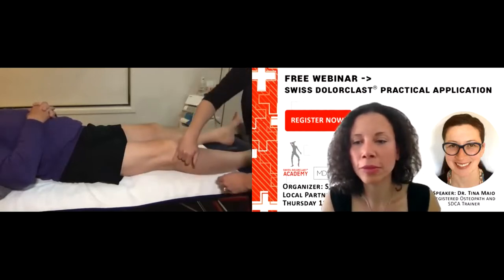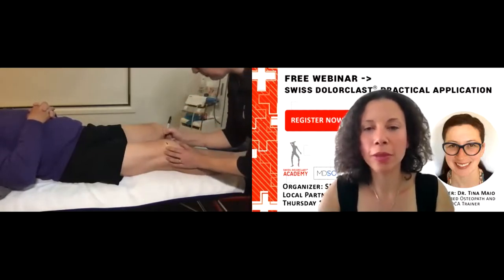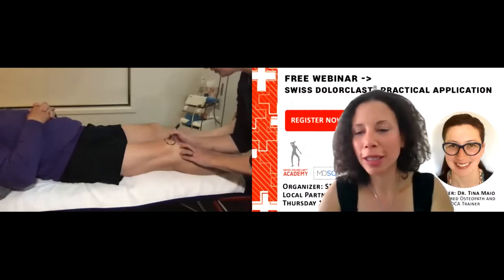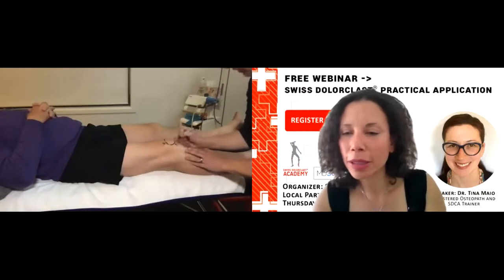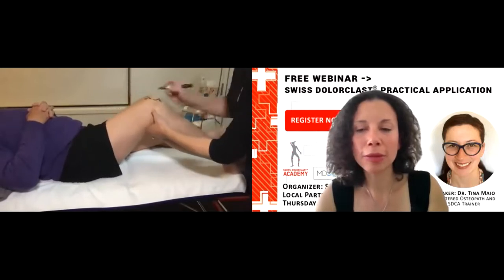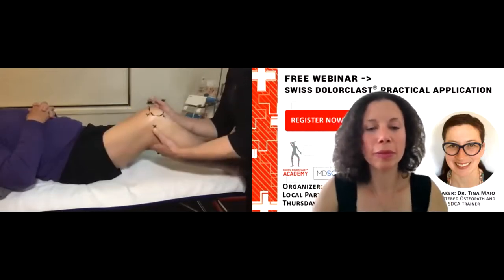So we're going to shockwave through the joint line, laterally and medially, and we're going to go around the poles of the patella. So if I mark, this is his kneecap. I'm going to give you a nice patella tattoo. I'm going to mark the 2 top poles of the patella and the 2 bottom. And then I'm going to mark laterally the joint line and medially the joint line. So I've got 6 spots I want to target.